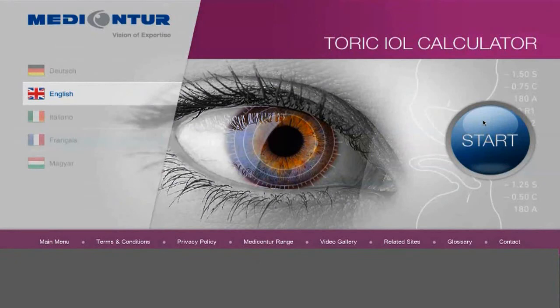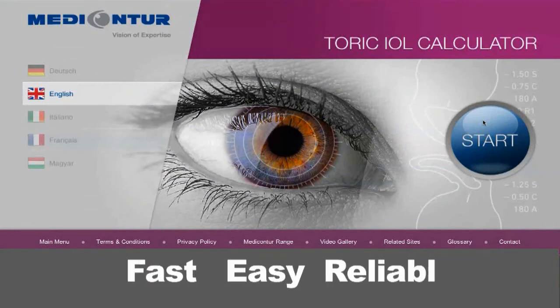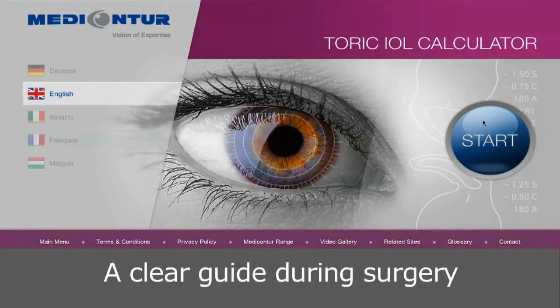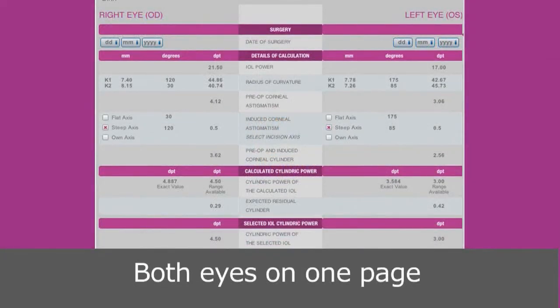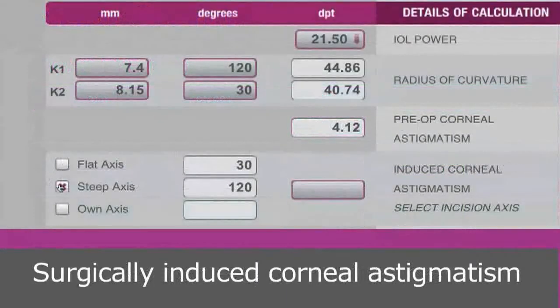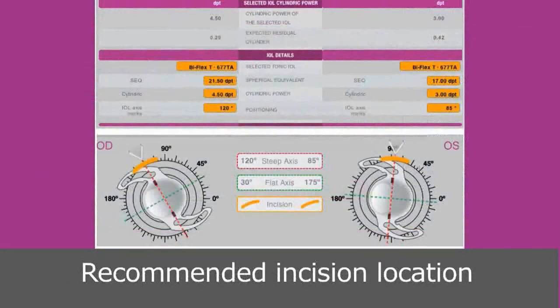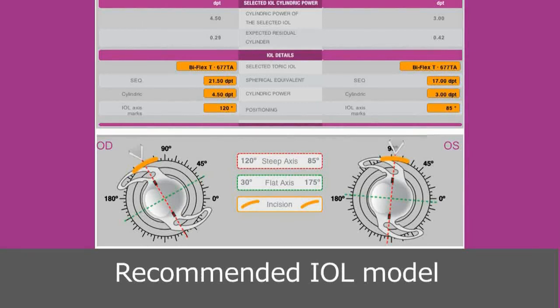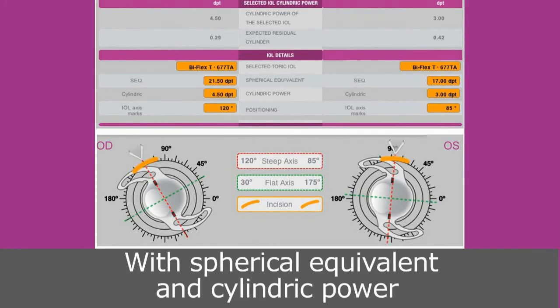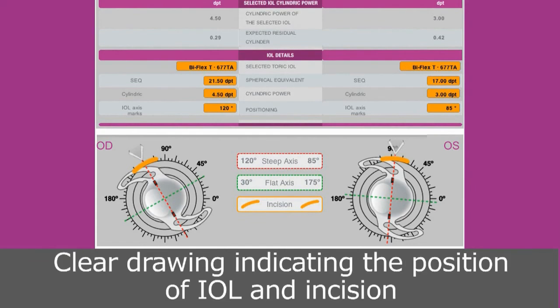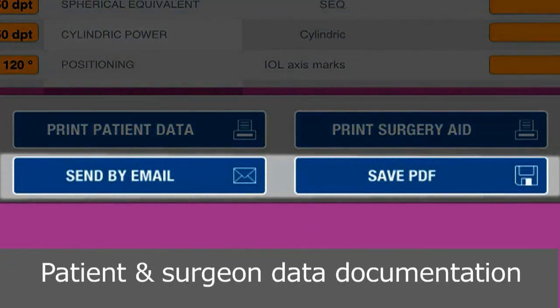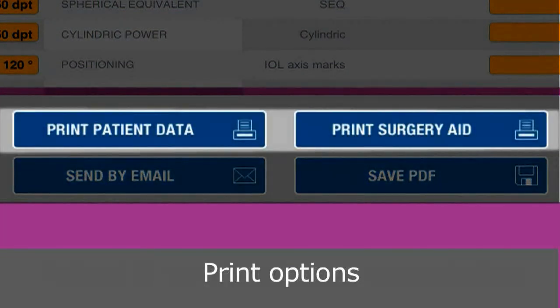In short, the Metacontour calculator is the fastest, easiest, and most reliable tool for surgeons to get a clear guide during surgery. With both eyes on one page, keratometry in millimeters, surgically induced corneal astigmatism on flat or steep axes, a recommended incision location on flat or steep axes, a recommendation of the IOL model with spherical equivalent and cylindric power, a clear drawing indicating the position of the IOL and incision, patient and surgeon data documentation, and print options.